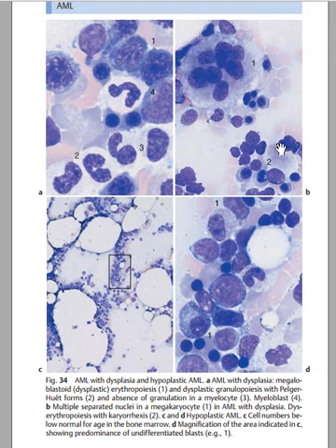In this case, the megakaryocytes have separate nuclei. See, there are different nuclei of the megakaryocyte. Now in this case, normally megakaryocytes should be very large, but you see that the megakaryocytes in this case are not as large as normal. And here is another megakaryocyte which is not very large. You can also see many large mononuclear cells, that is monocytes, at the level of the megakaryocyte.